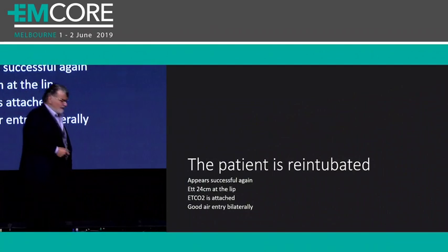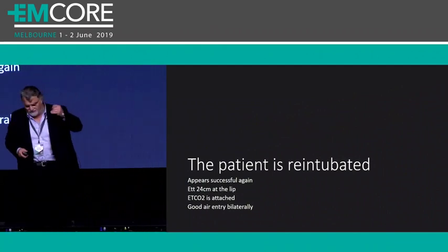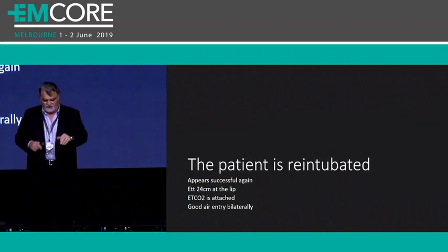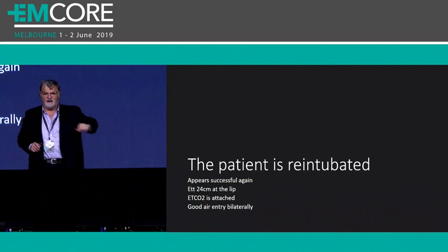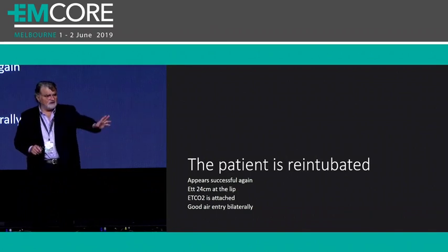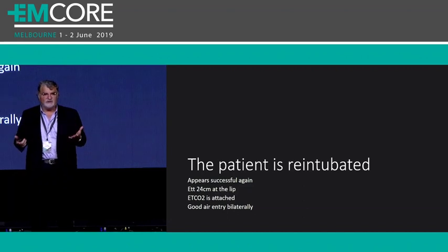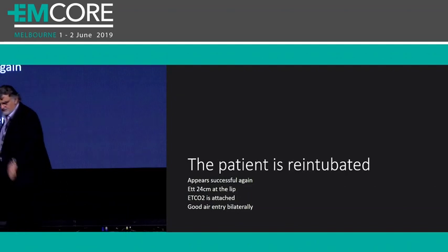So we pull the tube out, and I've done this before. You know, I've tubed the patient. I remember as a registrar tubing the patient, and I said, right, I saw it go through the cords, it's misting, I can see the chest rise, it's in. SATs aren't going up, I'm not getting an end-tidal CO2. And then you say, you're an idiot, take it out, it isn't in, right? So you take it out, we re-intubate this person.